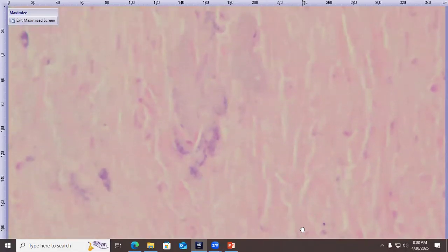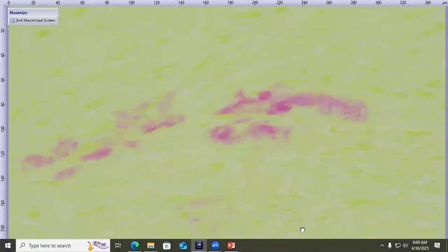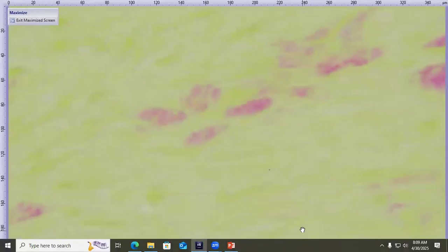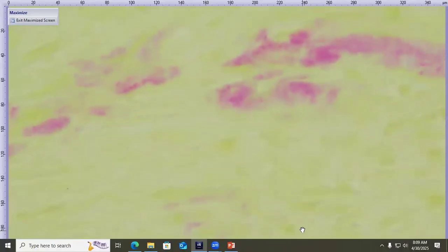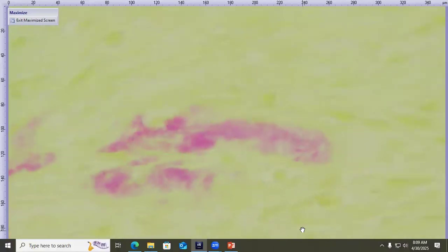Yeah, so these filamentous bacilli are scattered all throughout these areas of orbital necrosis. And we did do a gram stain. Somewhere I have a dot, so you're not seeing a sea of yellow. There we go. They're gram negative. Maybe not focusing the best, but these are the bacteria.